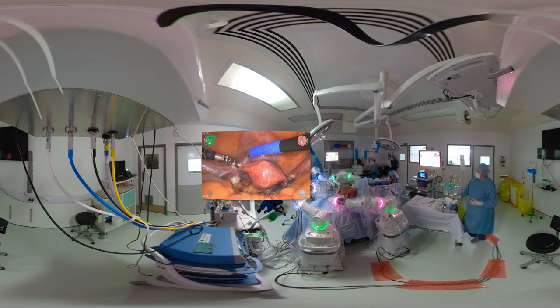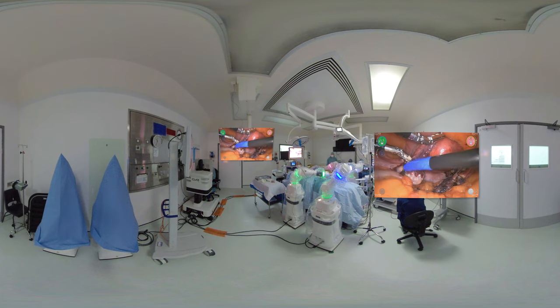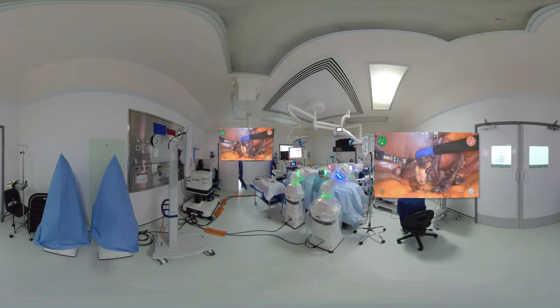This is the left side again — a similar sort of steps: the round ligament being coagulated and then cut, and you can see the ovary right there at the bottom. We're going to come to the infundibular pelvic ligaments after we've separated the broad ligament into two folds. You can see that separation almost coming out, and this is now the infundibular pelvic ligament. As this patient is having surgery for endometrial cancer, it is imperative we remove the tubes, ovaries, cervix and the uterus. We're trying to stay very close to the ovary here to avoid any damage to lateral pelvic side wall organs, especially the ureters.